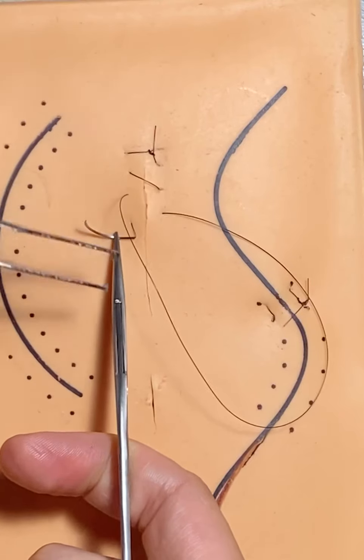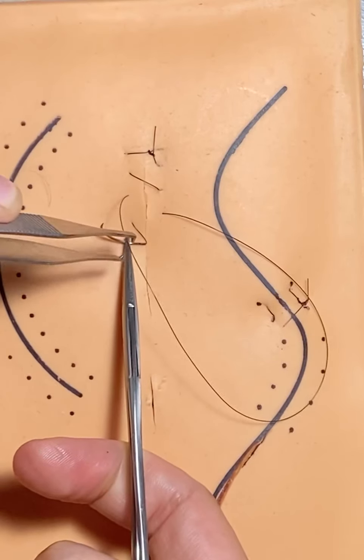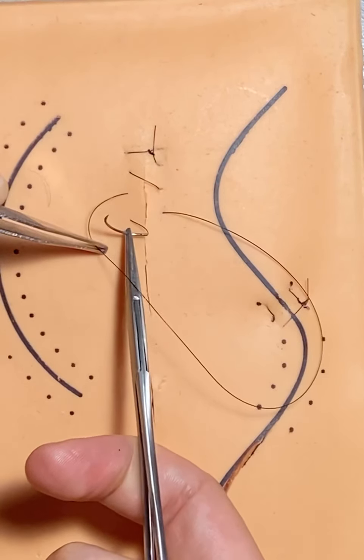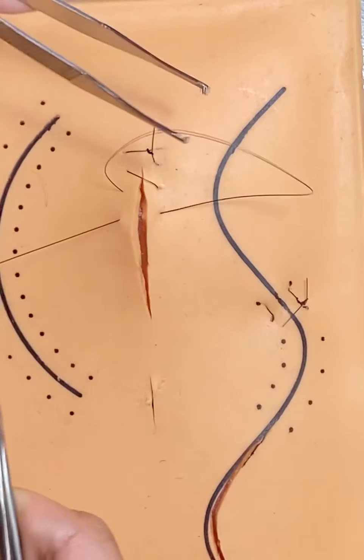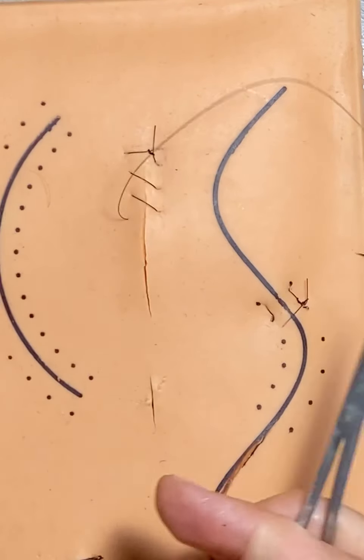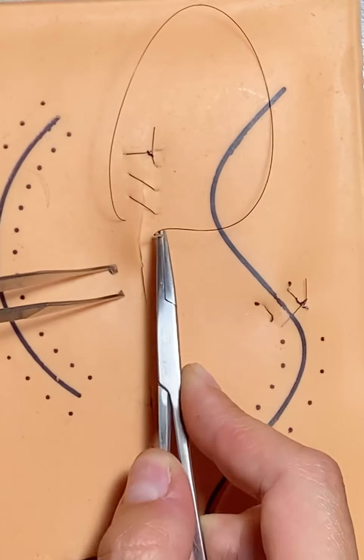You just want to make sure that you come out with your needle, not in your loop. That's a different technique that locks each one. That's not what we're doing here. Every time you pull it through, it tightens it down a little bit more.